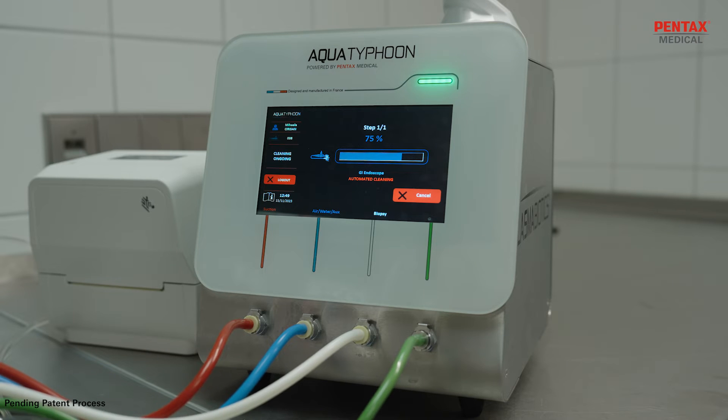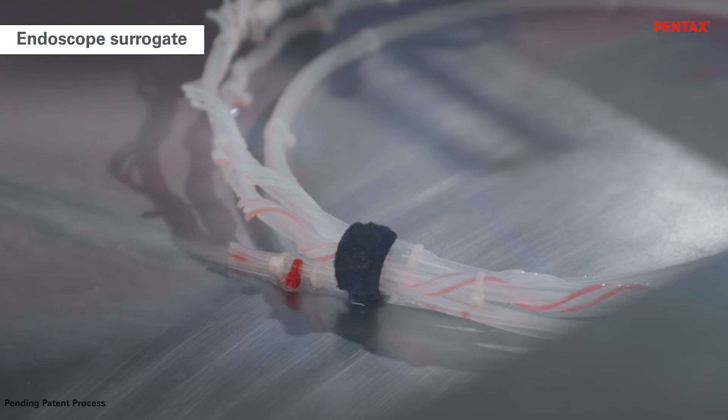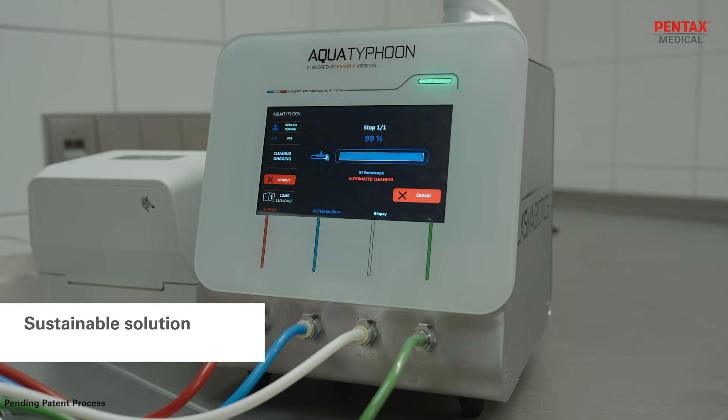No brushes, syringes, or detergent are needed. Water consumption and total cycle cost are reduced, making Aqua Typhoon a highly sustainable and economical solution.